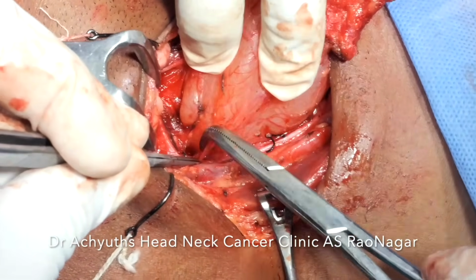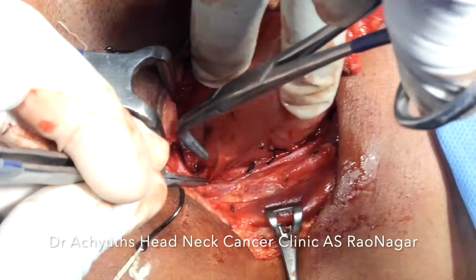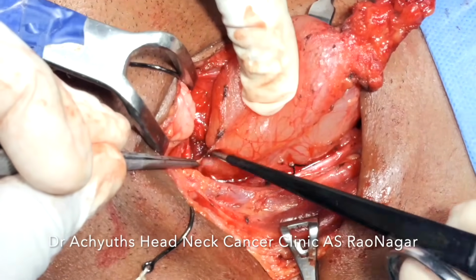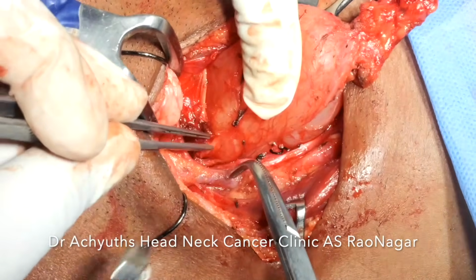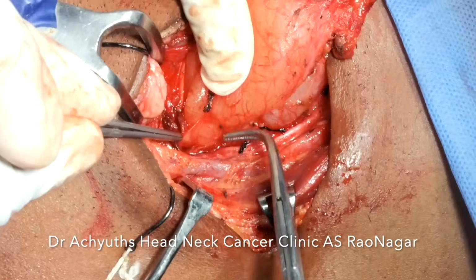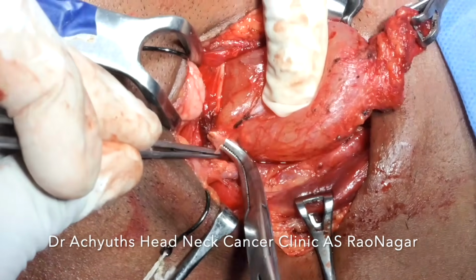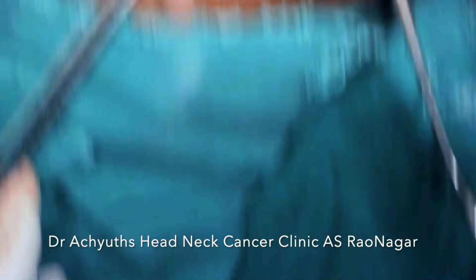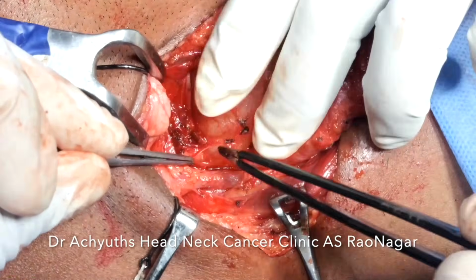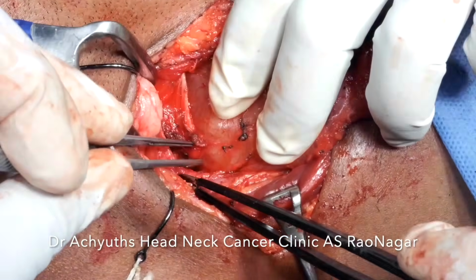So again, as I told you, we cannot finish the entire work on one side and then go to the other side. It is always that you go around the cyst. Sometimes you work there, then you find that this is more approachable, this is more dissectable now, then you dissect this area, then go to another area. In that way, it is more about delivering the cyst outside. Definitely the work should be systematic, but it is not that we have to finish the entire work on one side and then come back to the other side.